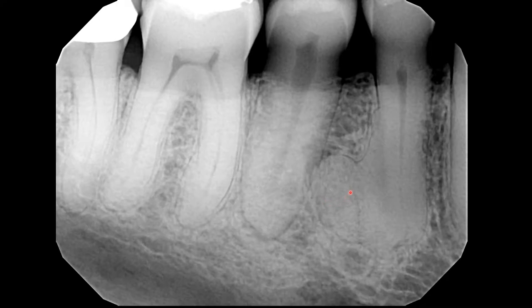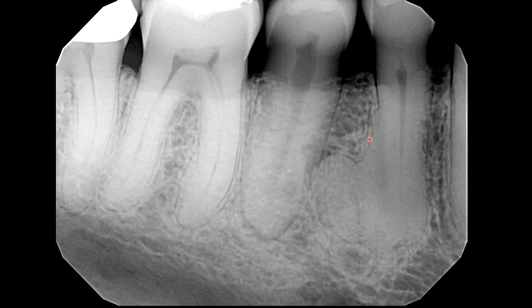On the distal part of the premolar is a well-defined homogeneous radiopacity. This radiopacity is continuous with the root, and there is no demarcation between the root and the radiopacity. We can trace the periodontal space, which follows the outline of the radiopacity. The density of the mass is similar to tooth structure, similar to dentine.